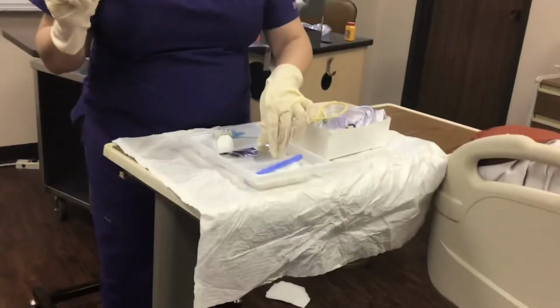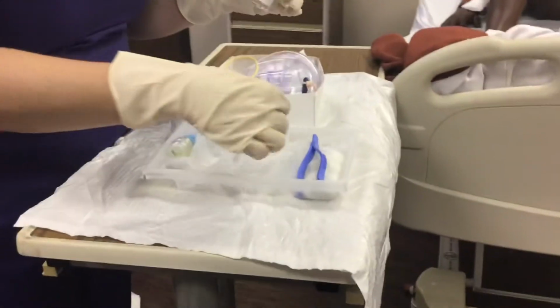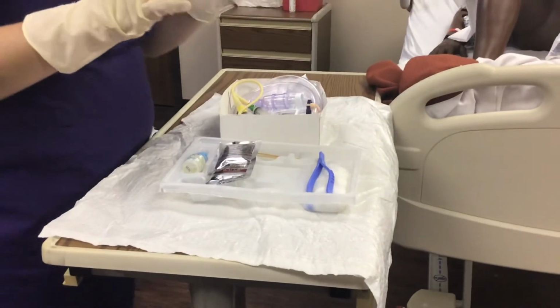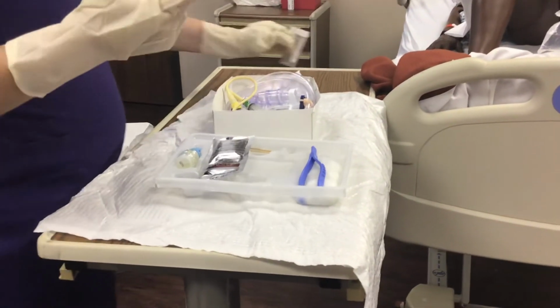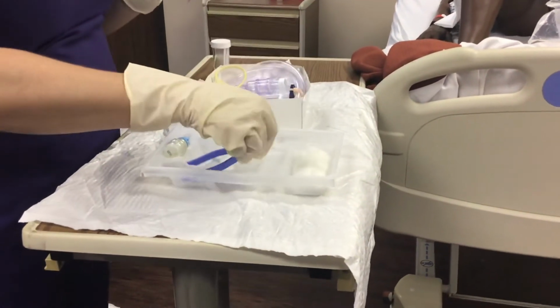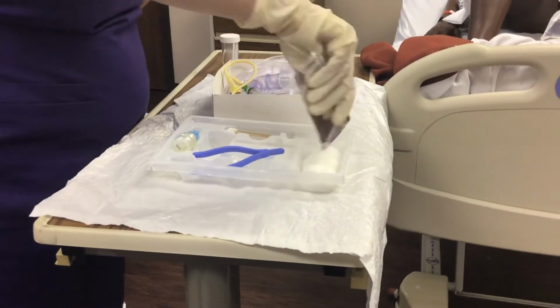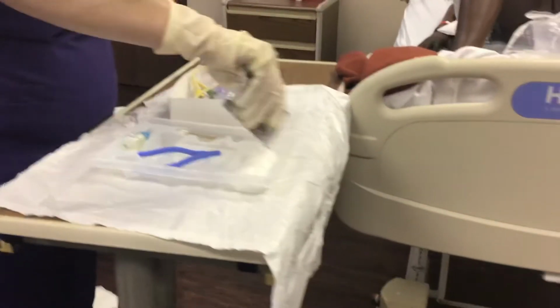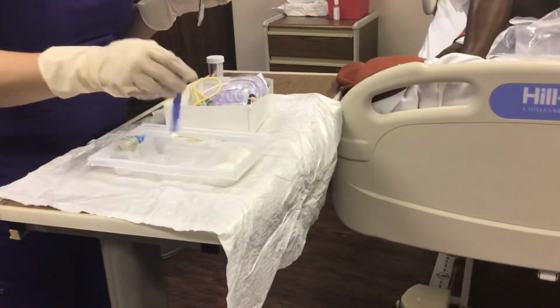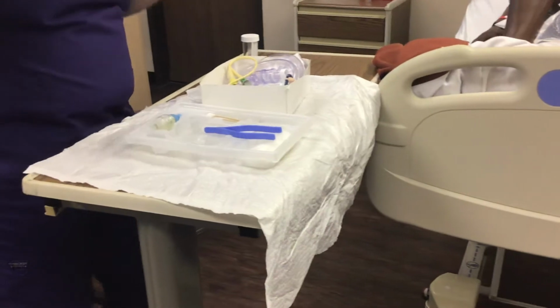All right, next thing I'm going to do, I'm going to remove this, and that's okay because we're not using it. And I'm just going to place it on the table because sterile on sterile is sterile still. All right, now I'm going to open my betadine, squirt it all over my cotton balls. Put that there, and again, dropping that.